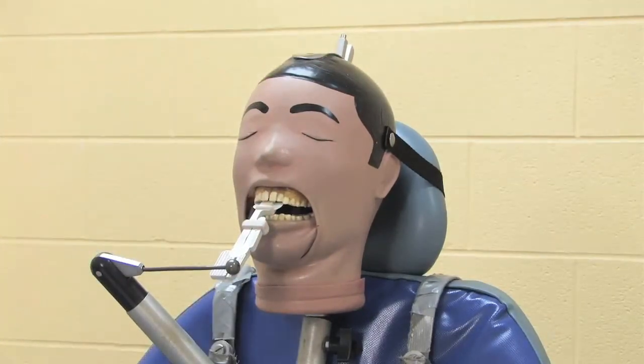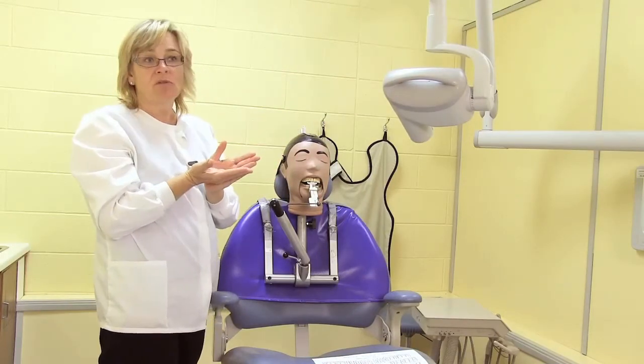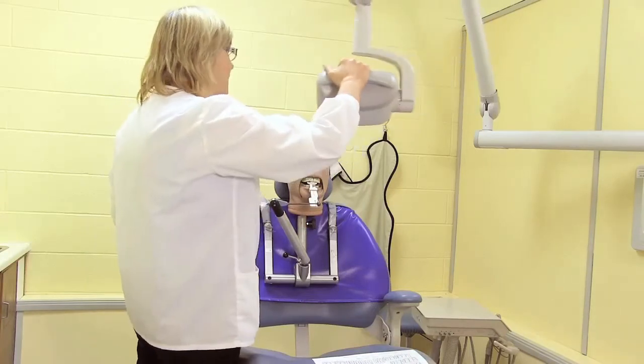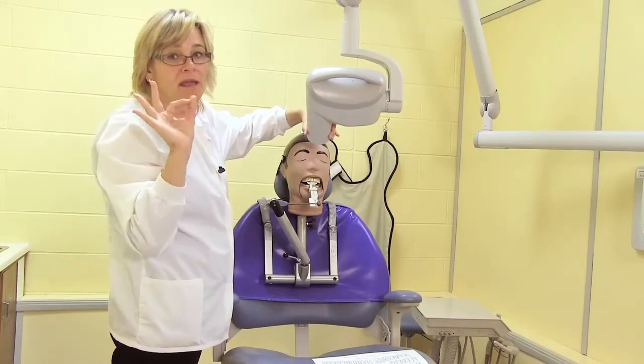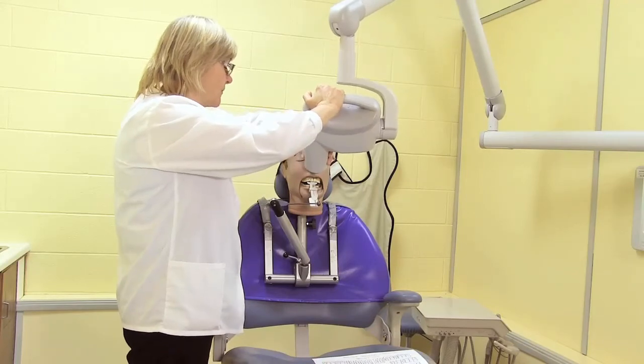What are my dislikes? My first dislike with the snap array is that the film can bend easily, which will distort the picture. Also, there's the extra exposure from using the finger to stabilize the bite block or the snap array instrument. What also can happen is that when held, it can be moved by the client inadvertently.